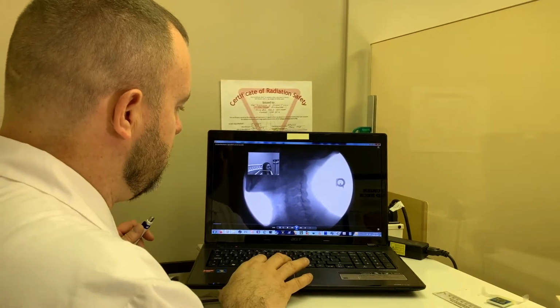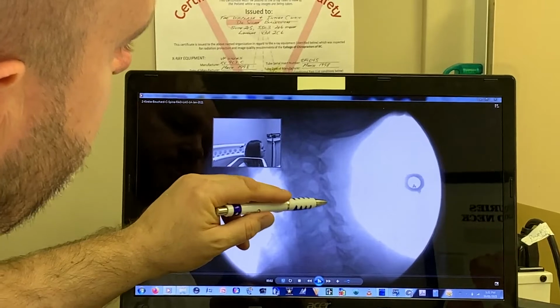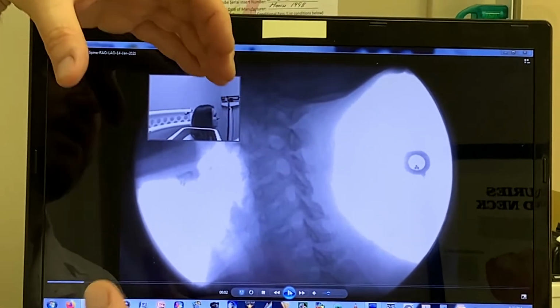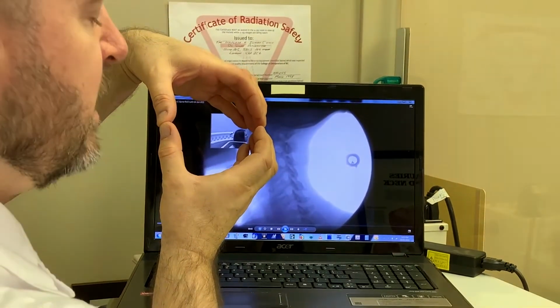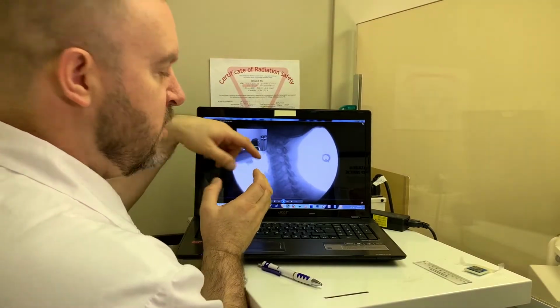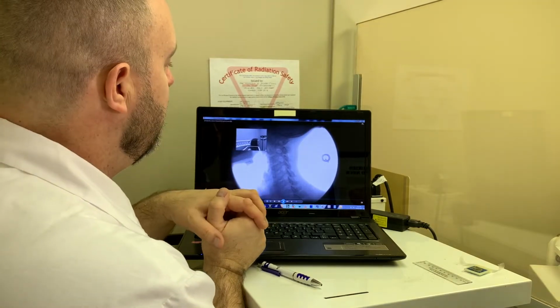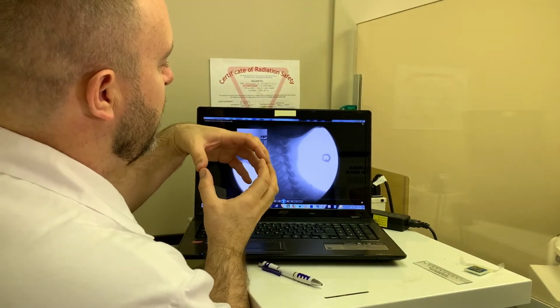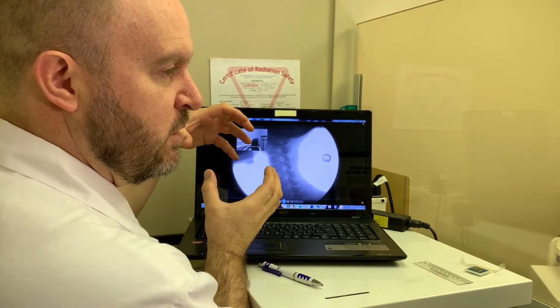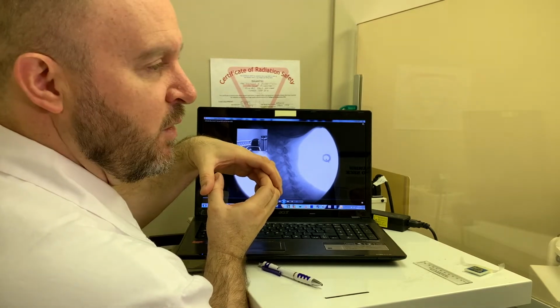With this one, as you rotate your head out of the way, you see these light-shaped ovals. So those ovals are formed by an archway of one bone and an archway of the bone below it that goes the other way. And so they form what looks like an opening, and through that opening is where the nerves exit. So one nerve will come out of this one, one out of this one, one out of this one, and it'll go to a particular part of your shoulder or arm or hand. And then so when you bend your head forward, those bones separate, and so this opening becomes larger. And then when you bend your head back, those openings approximate, or those arches approximate, and the opening becomes smaller.